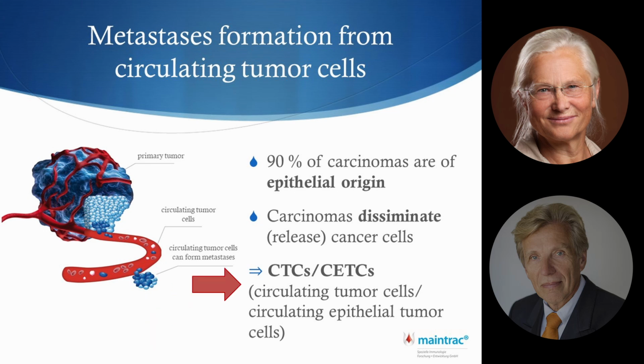We call these cells not CTCs, but CETCs, circulating epithelial tumor cells, because the Maintrac approach can only detect the epithelial cells. But I will show also that cells with stem cell characteristics, which may sometimes not express epithelial antigen anymore, can be detected by the Stemtrac assay.